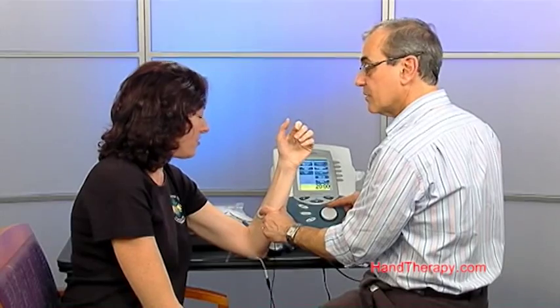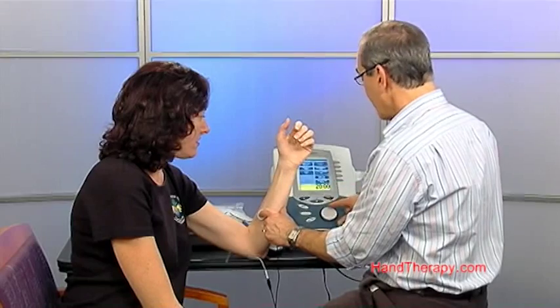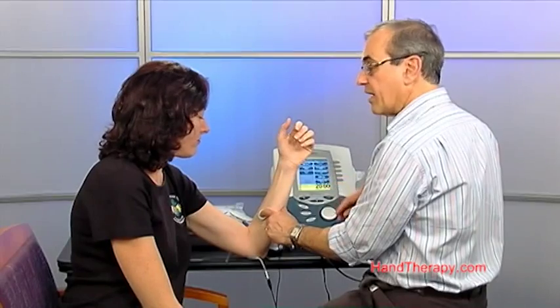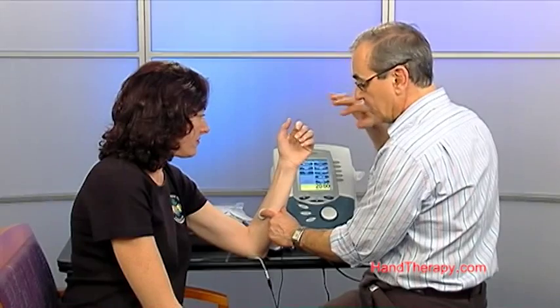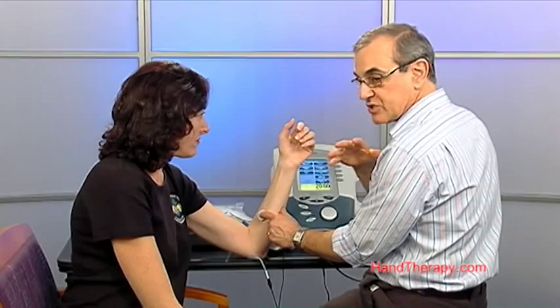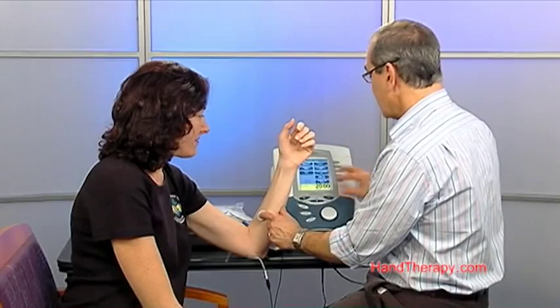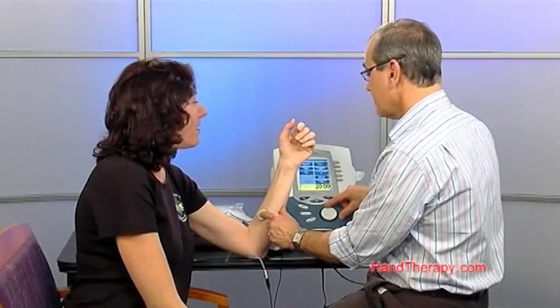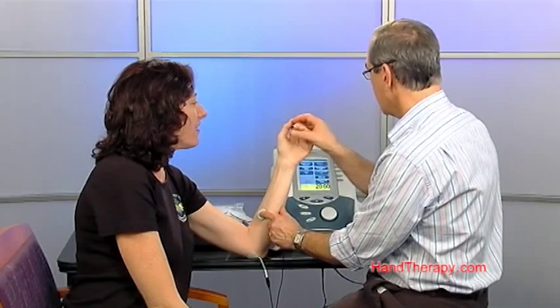You're getting just a tingle — is it uncomfortable? No. We have not yet reached the threshold to depolarize the membranes to allow for a contraction, as we discussed in the lecture. Now we're going to continue to bring the threshold up — and there's our muscle stimulation.